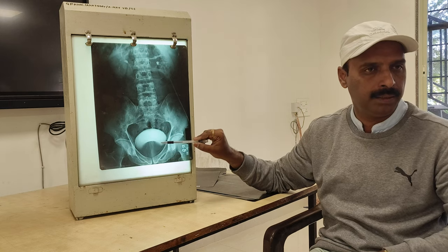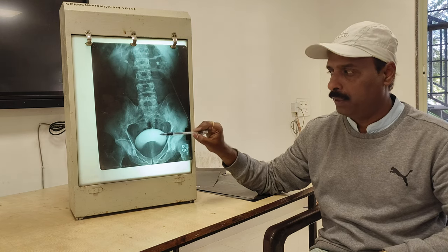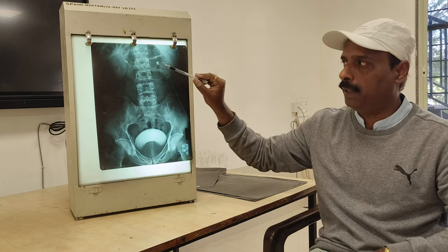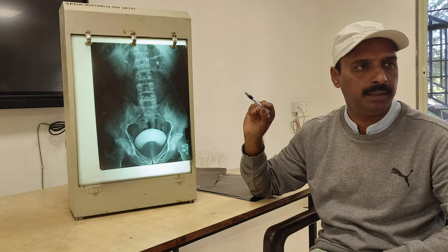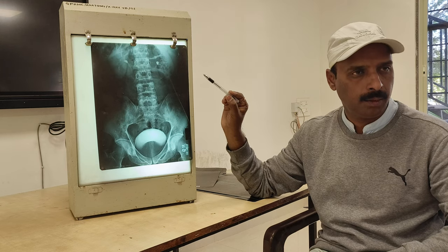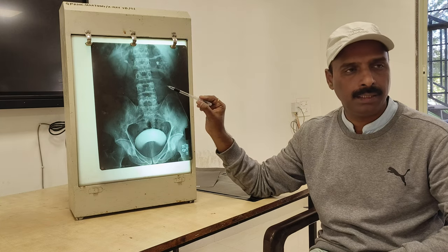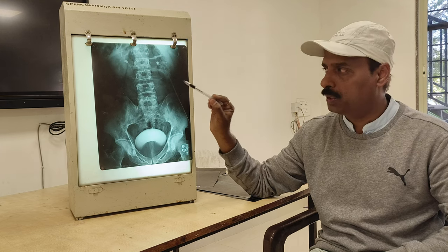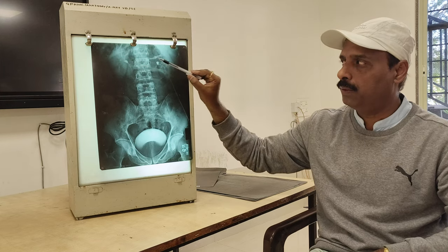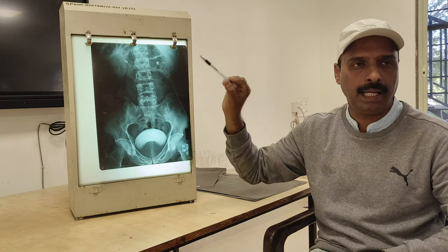Here the bladder is filled, as this pyelography was taken when the dye reached the bladder. So there is the urinary bladder, then the ureter, and these are the shadows of the right and left kidney, both having kidney stones. How to comment on or read this X-ray: this is a contrast X-ray, an intravenous pyelography, showing the right and left kidney shadows, and the white shadows like stones are in the right and left kidney.